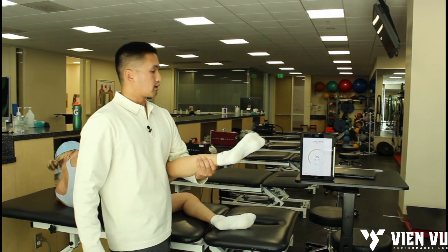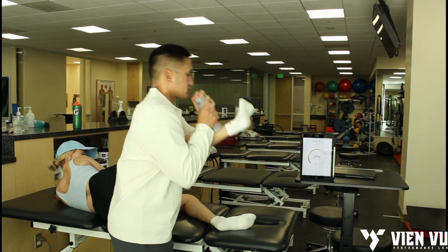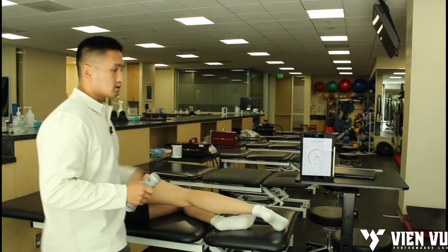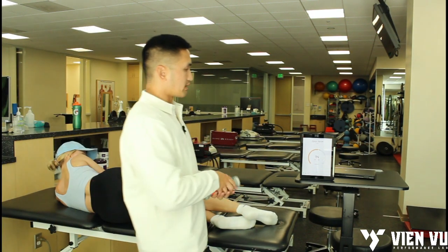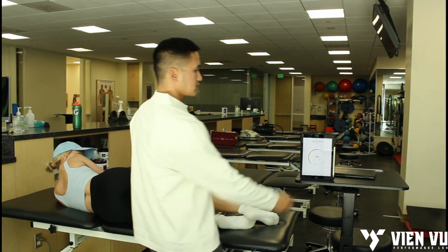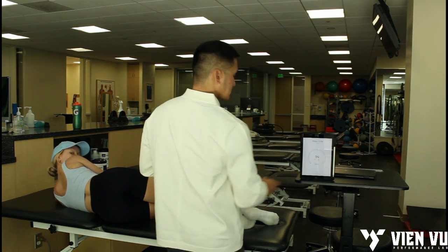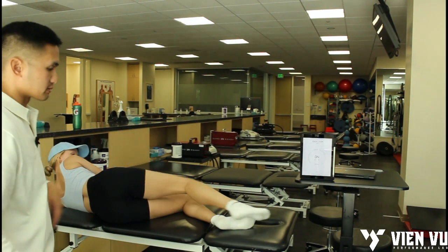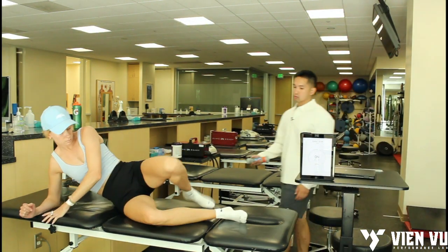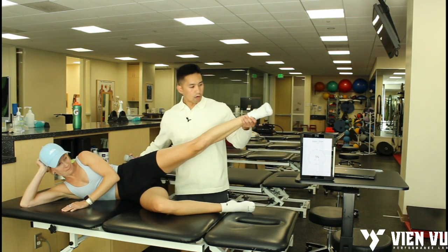That one will automatically record that trial. Ready? Hold here and go — push, push, push and rest. Good. I took two trials there, but for the sake of this video we're going to do just one rep for most of these. I'm going to hit Next and it's going to go into the left side, so I'll have her slip over to the other side.